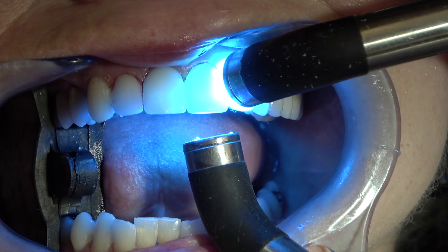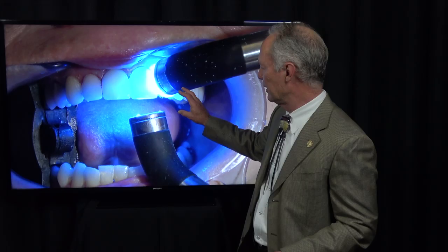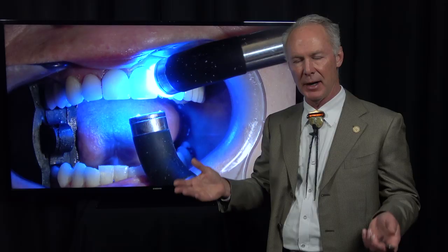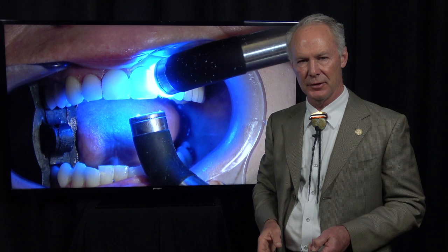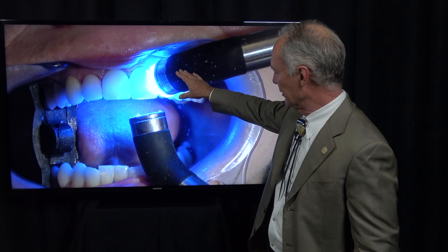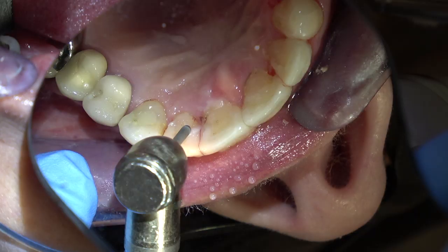Now we're going to come back and cure these with two curing lights on the facial and the palatal, 60 seconds each. That's way overcure. You probably don't need to cure them that much, but you can't overcure a composite. You could undercure it. So if I jump out of an airplane, I want two parachutes, not just one. One's going to work most of the time, but I'd rather have two. So in this case, why not overcure it? So we're going to give it 60 seconds on both the facial and the palatal surface.